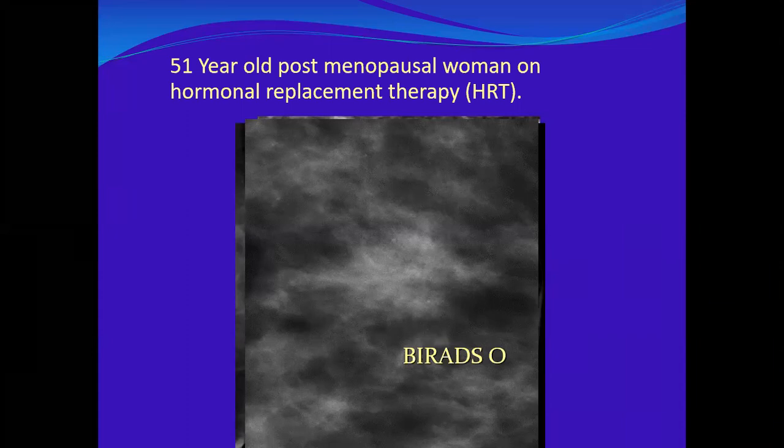Okay. If it is malignant, I would think of DCIS. It can be DCIS. It can be lobular carcinoma also. It can be lobular, it can be ductal, it can be tubular. This is if it is malignant. If it is benign, it can be, benign maybe.